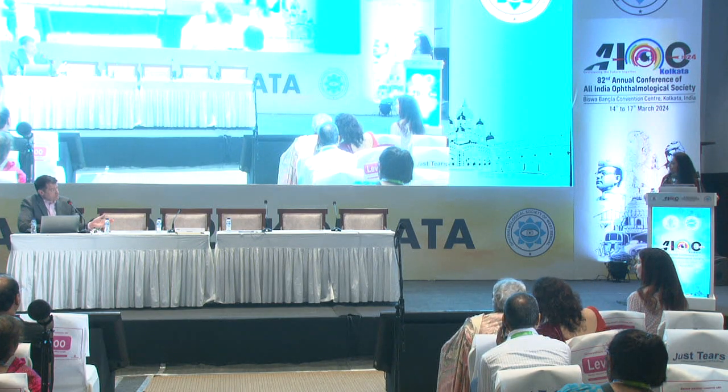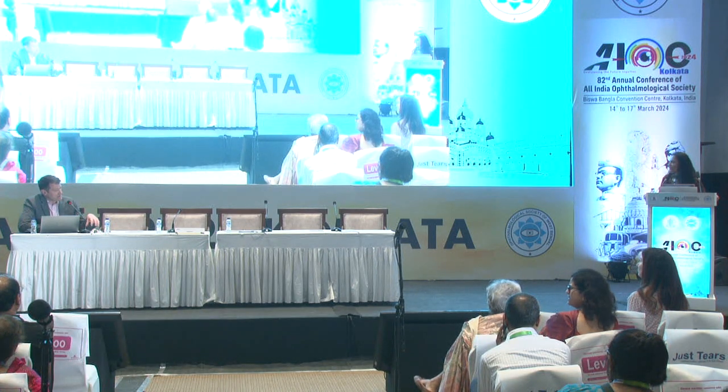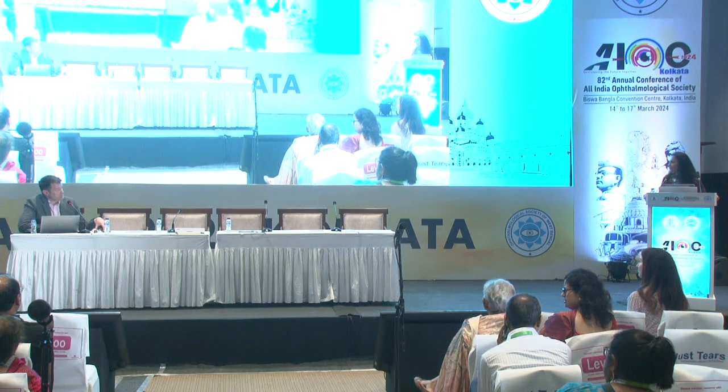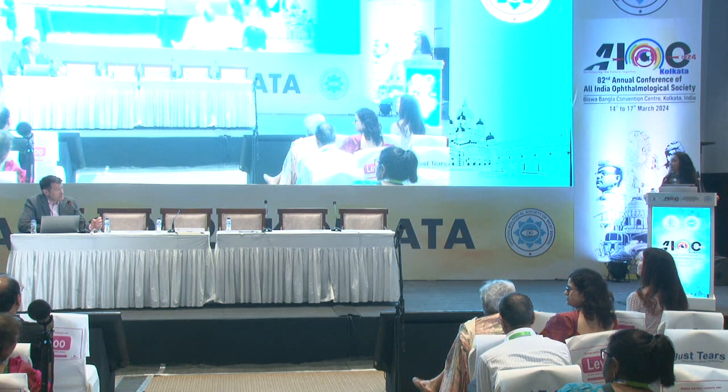And then the second question, you mentioned that torics are an option for patients with keratoconus who have a PK for keratoconus, let's say because if the endothelium fails, you're going to be doing endothelial keratoplasty. But I think we've all seen these keratoconic patients who over decades tend to get that thinning at the inferior graft host junction and that anterior protrusion. So I've had the displeasure of doing a fair number of PKs because I had to do a PK on a keratoconic patient because of that sort of ectasia at the inferior graft host junction. And these are folks, many of them with torics in, right, which then becomes problematic.